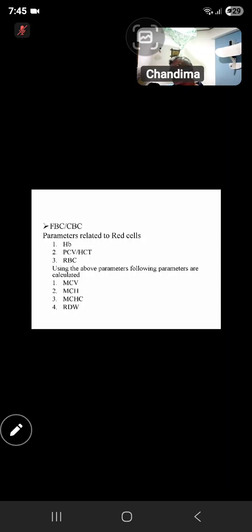They calculate the total volume of these 8,000 cells. And finally, divide the total volume by the number of cells and average. The mean cell volume, or the average cell size, is going to be given as the mean cell volume. It is going to be named MCV. Finally, the MCV is going to be multiplied by the total count, and it is going to be given as the HCT or the hematocrit.